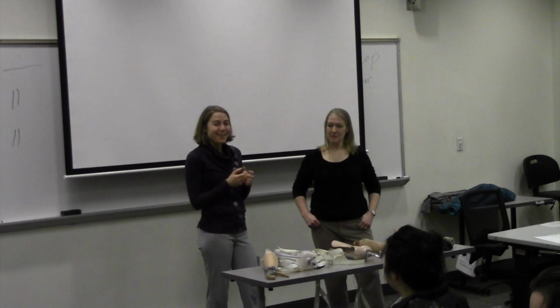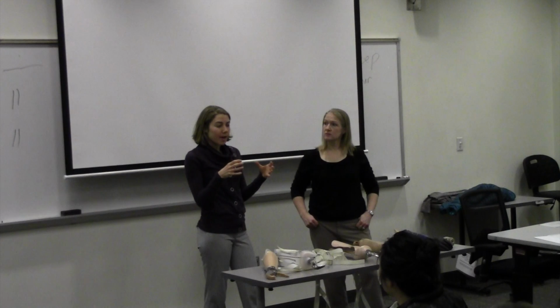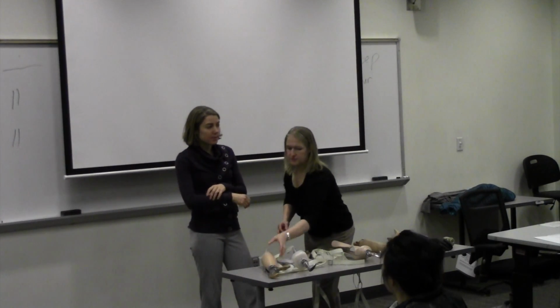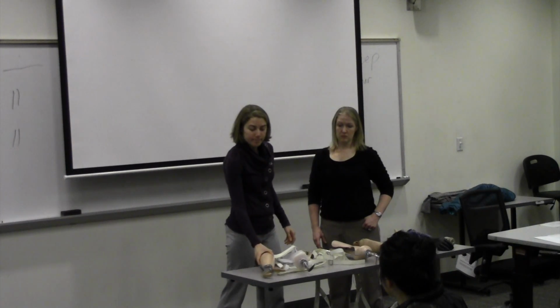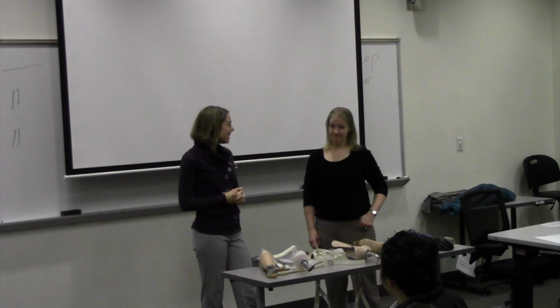Then we take plaster away and add plaster in places that we don't want them to get pressure, if that makes sense. And then from that, clear plastic is pulled over this model, and so we end up with a clear plastic socket like this. Because it's clear, we can try it on the patient and see how the fit is, and we ask them to do different movements to see how it's fitting, and then from there, if we're satisfied, then it gets laminated and turns into a more definitive socket. So that's kind of the overview of how the process works.